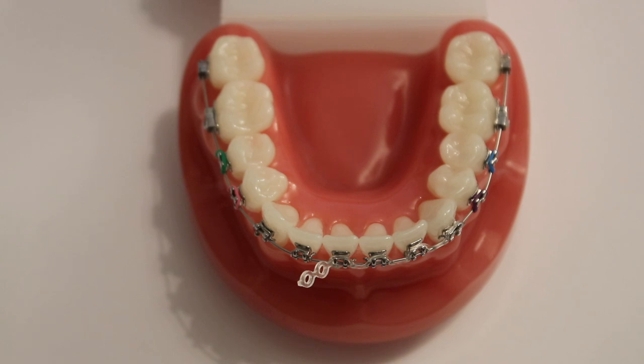You may find that your elastic chain frays or becomes loose around your brace. Before doing anything about this, it may be useful to discuss the situation with your orthodontic provider.